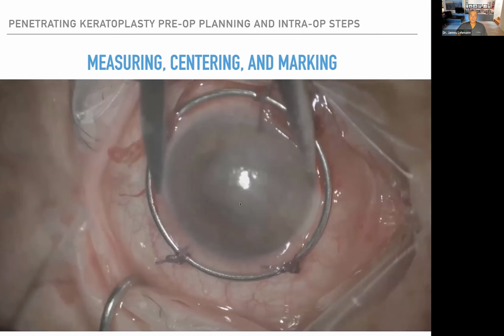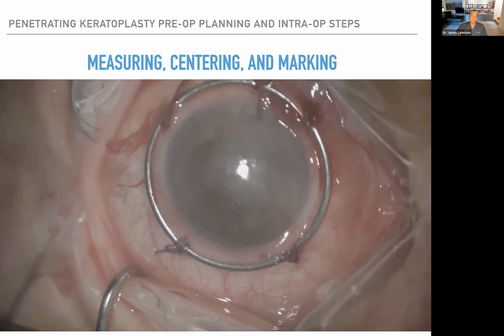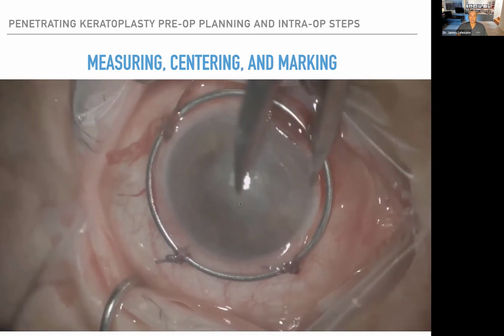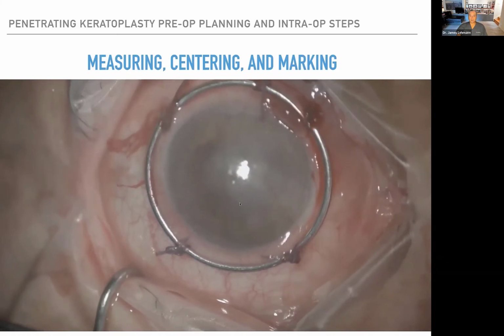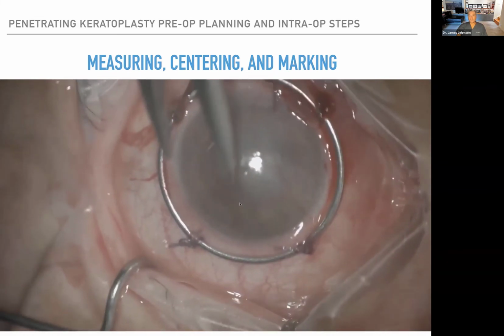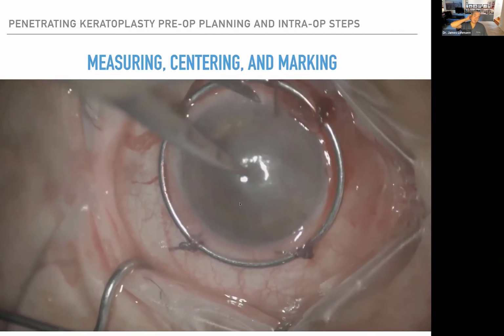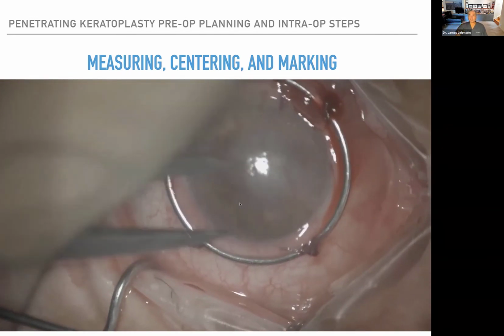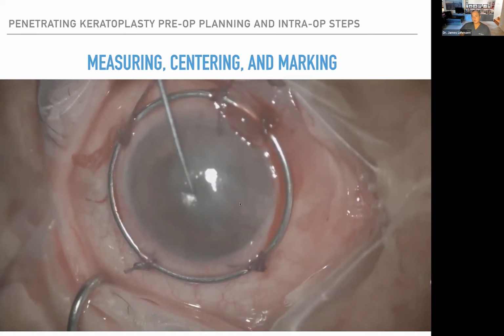Okay, so measuring is very important, okay? In this film, I'm going to show how to measure the cornea and mark it for your suturing. This is a technique where you measure the horizontal diameter of the cornea. Let's say it's 12. You go half of that on the calipers, and then you mark the central aspect of the cornea. Then you measure the vertical diameter and do the same thing. You want to get that geometric center of the cornea and then mark it with a Sinskey hook that you painted with a marker.